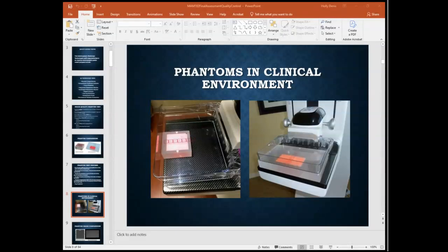Yeah. Okay, good. So right here is what's along the chest wall. So your patient is here, the breast is right here where this phantom is. So this is the chest wall. And on this image, obviously this is the chest wall. So you wouldn't take this phantom and put it way in here and do the images. You would do it right here where a breast would be. Now, that's not to say everybody would be that size, but like I said, this is the average size breast that it's supposed to be mimicking. So that's what it looks like in the clinical setting.